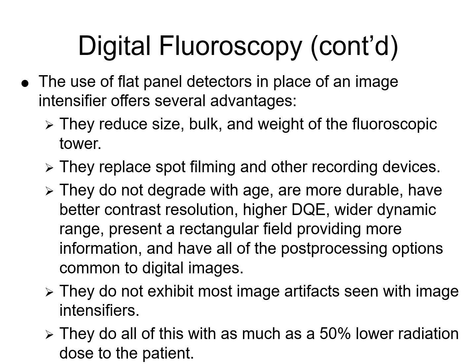Okay. You can do post-processing. You don't get degradation. Very much like there's no real moving components to a CCD, there's really also no moving components to a flat panel array. Okay, and so again, the same advantages that a CCD had over a conventional television camera, the flat panel detector has the same advantages over an image intensified system. Okay, so durability, no moving parts, so no parts to wear out or break down.